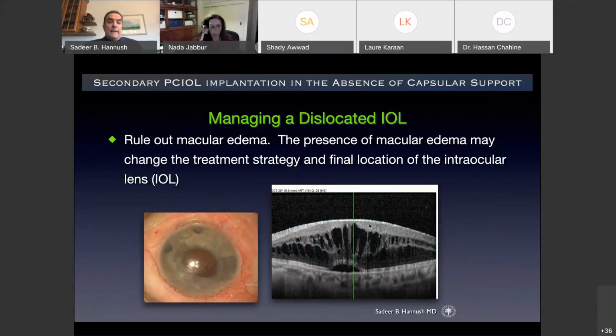Here's another common scenario. A patient with an anterior chamber implant did well for a while, referred to you by the referring ophthalmologist because of the picture in the slide on the left. You do an OCT and you see the picture in the slide on the right. The vision is about 20/80, 20/100, and he's referred to you presumably for a poorly positioned anterior chamber implant. But the reason for the visual compromise is the significant CME. This is a retina with a central retinal thickness of about 800 microns. So you know that this is the problem.